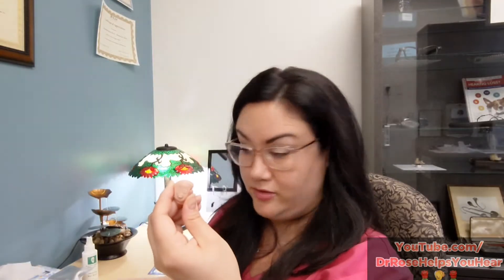On these types of hearing aids you'll find little slits, and that's where you want to brush. In-the-ear hearing aids less often have debris compared to smaller aids, but for in-the-ear models the microphones are usually right above the battery door, so it's good to brush over that whole face plate.